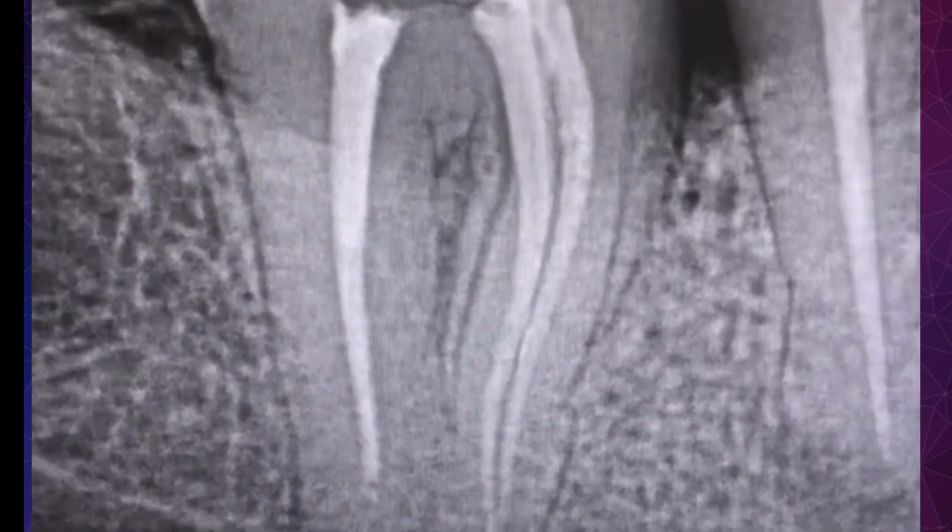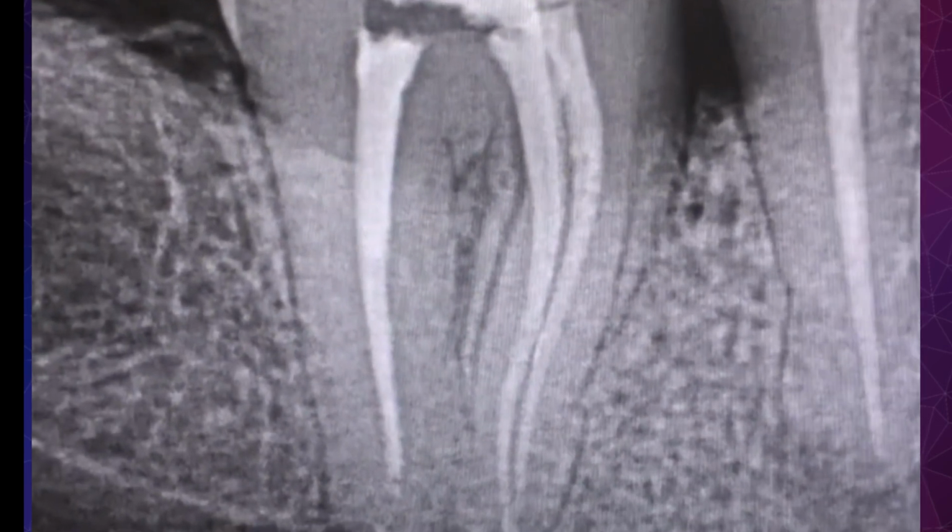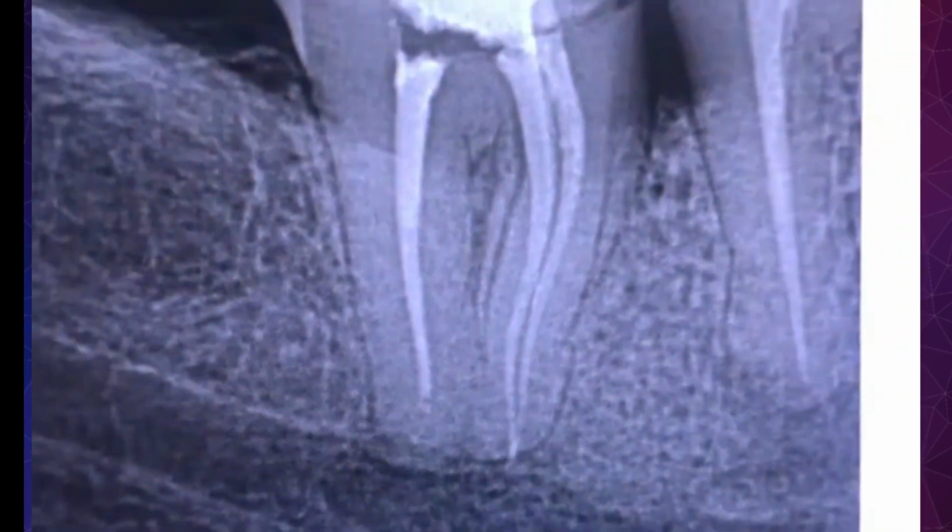I confirmed it, of course, using my electronic apex locator and also sterile paper points. And take a look. Look at how many portals of exit we have here. That's 1. That's 2. That's 3. That's 4. That's 5. Everything went great, as you can see. We went ahead and temporized the tooth and referred the patient back to his dentist for the permanent restoration.